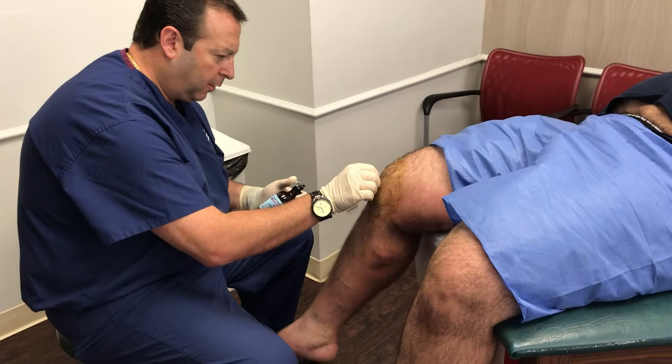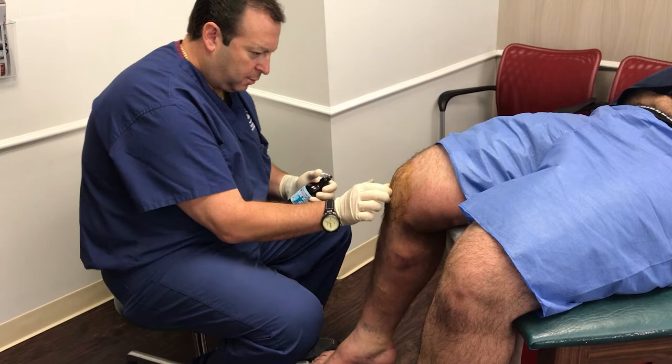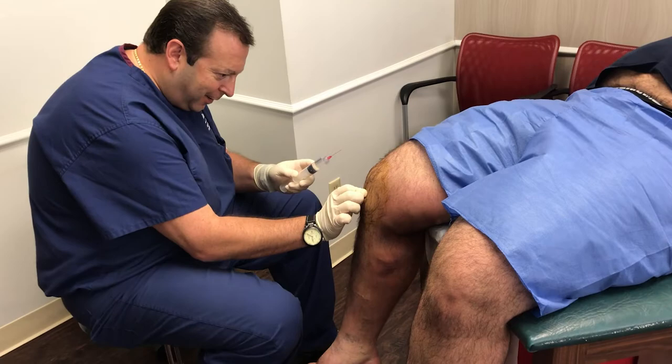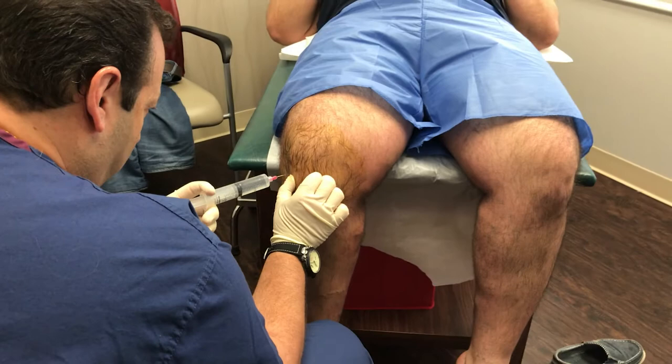Just relax your leg as best you can. The best thing you can do to help me is not help me. All right, here we go. Needle stick — a little pinch, a little burn.